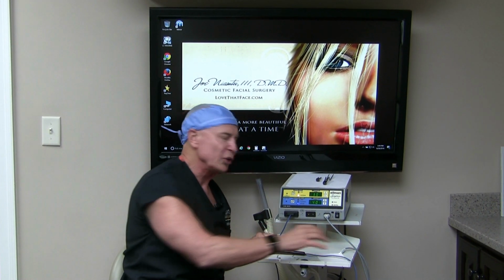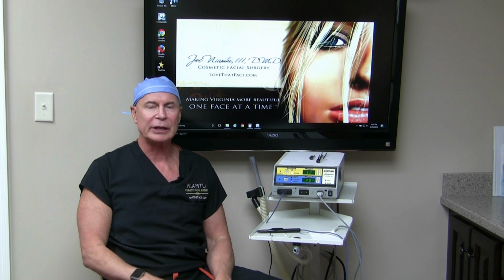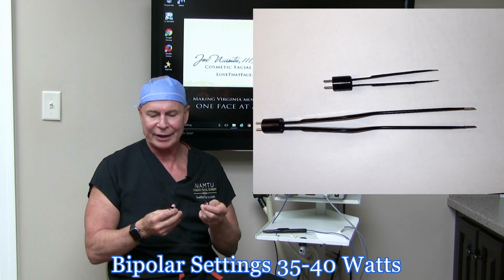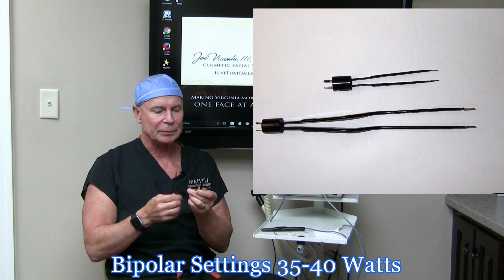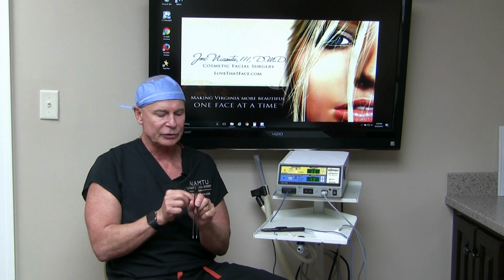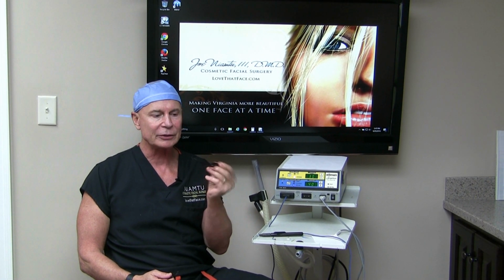Now, if you do any type of surgery, like cosmetic surgery, especially blepharoplasty or facelift, you absolutely 100% have to have a bipolar system. And with the Ellman, they have a ton of different electrodes that are bipolar. I like these silver tipped. It's a special silver alloy, and they don't cake as much as the plain steel electrodes. So we use the big one for facelift surgery, neck procedures, or if you had to do something on the uvula or pharynx or palate, you could use that.